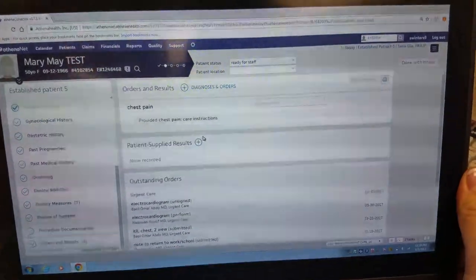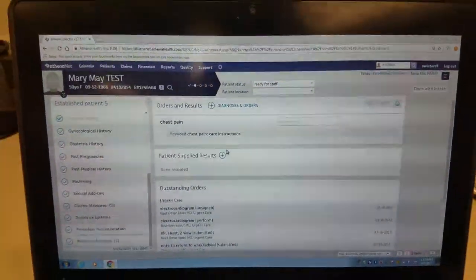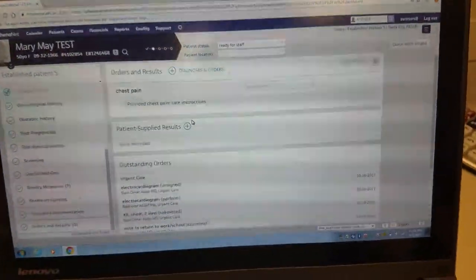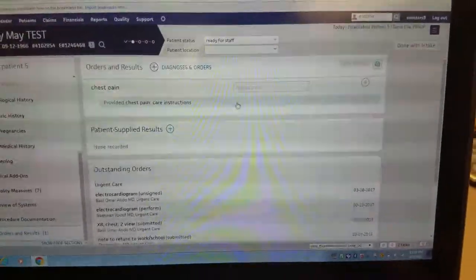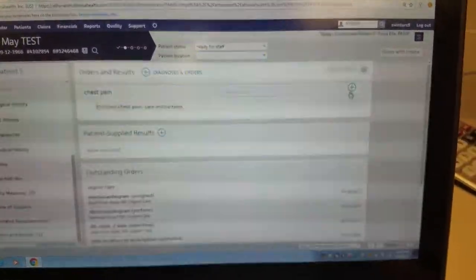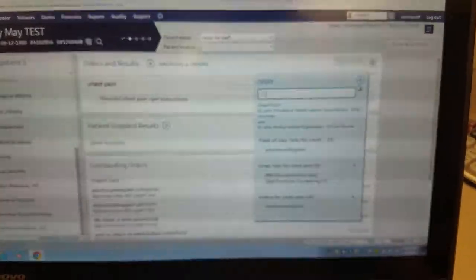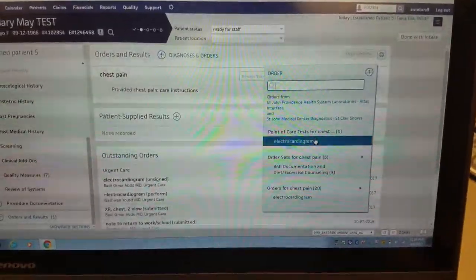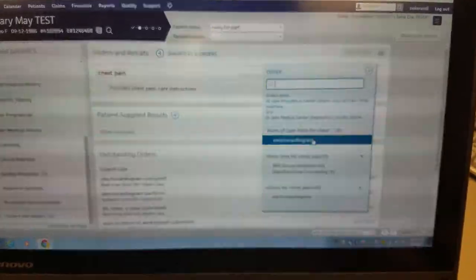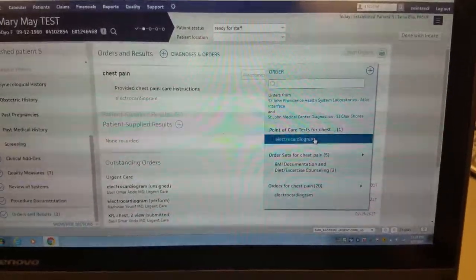So I'm going to show you how to do it in Athena. So this is a test patient. We're going to use the same point-of-care test electrocardiogram.